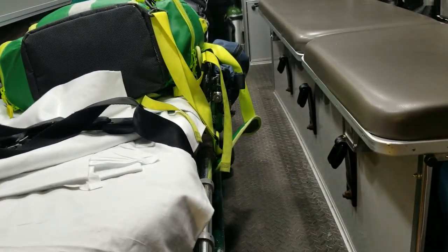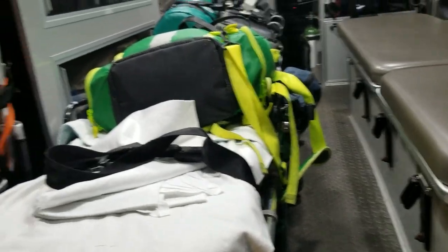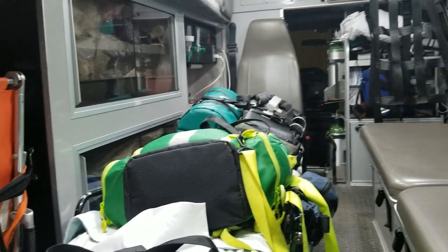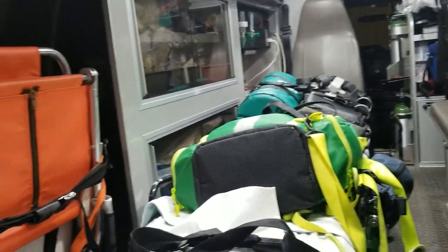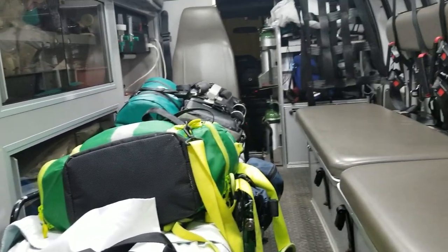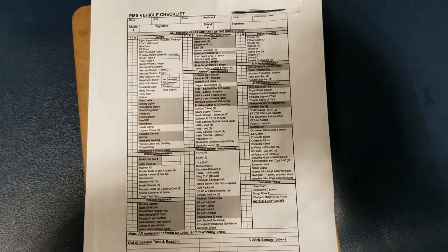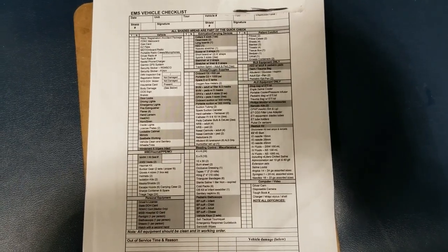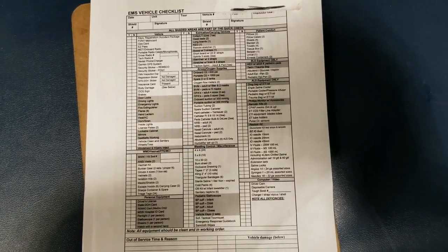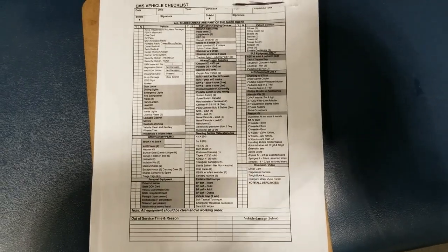My systematic approach is: BLS before ALS, check the bag, wipe everything down, then strap everything in. I also have a systematic approach for starting an IV, and that's what helps me do it with ease. You don't have to do it the same way I do, but as long as all the bases are covered you should be fine. It's a checklist we use at the beginning of every single tour.